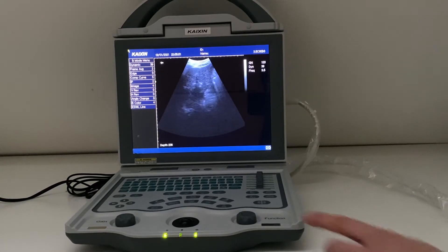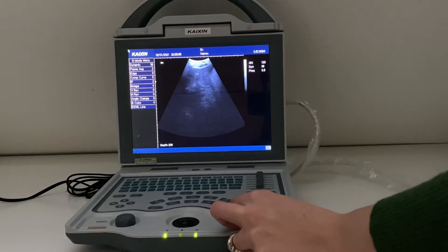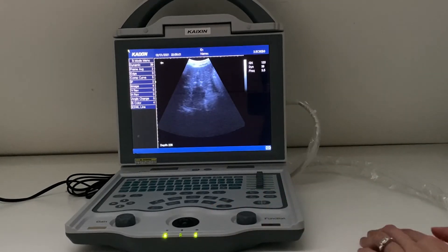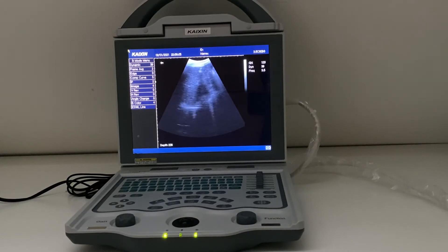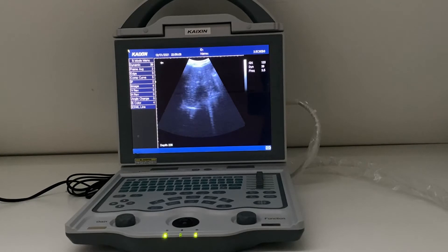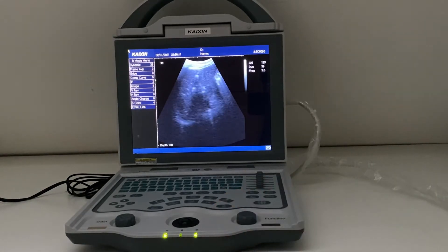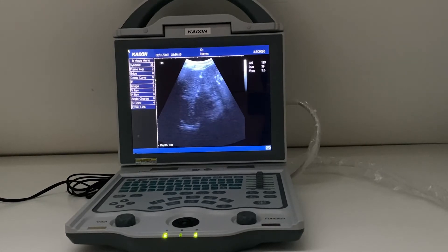For depth, it's the function knob on the right hand side. The idea is to start with a greater depth and then reduce it once you've found something. So if I was looking at some detail on my liver, I've got my liver because I'm at a great depth, and then I reduce to make sure that my liver is filling up all of my area of interest.